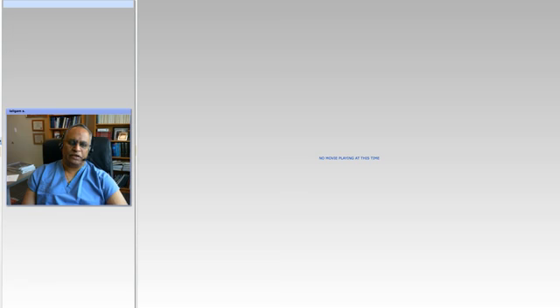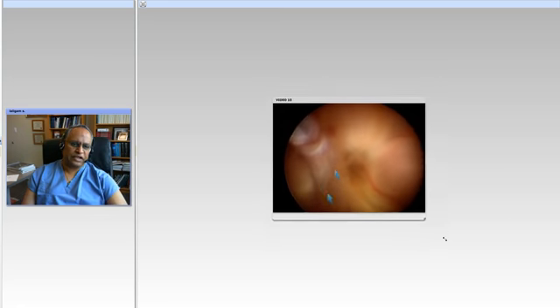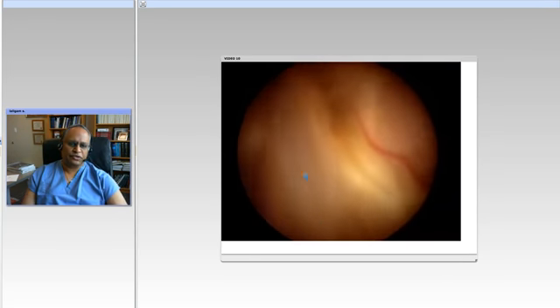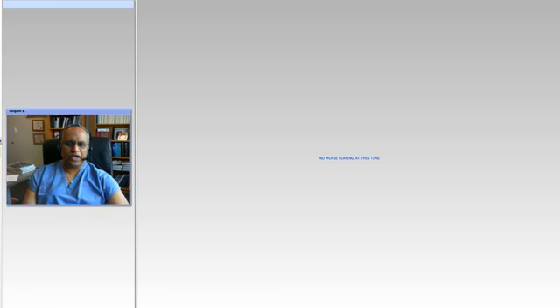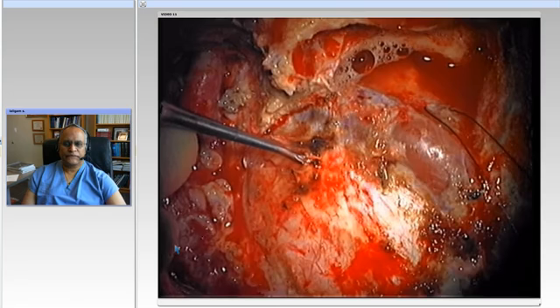What we did here was, we didn't have a radial artery, so we used a saphenous vein. Actually, this lady first had an endoscopic fenestration by my associate, Dr. Ellenbogen. And here is a catheter. The coils had actually migrated through the third ventricle into the catheter. We did fenestration of the cyst onto a shunt. So those are the coils that you see. That's the first thing that was done with the patient. Then we performed a petrosal approach and saphenous vein graft bypass.